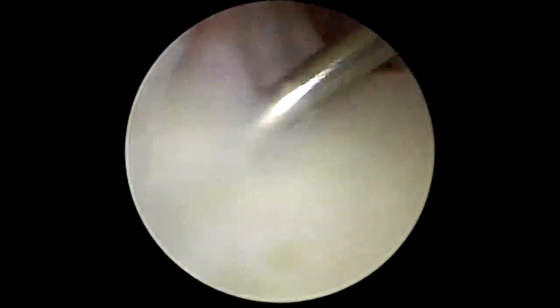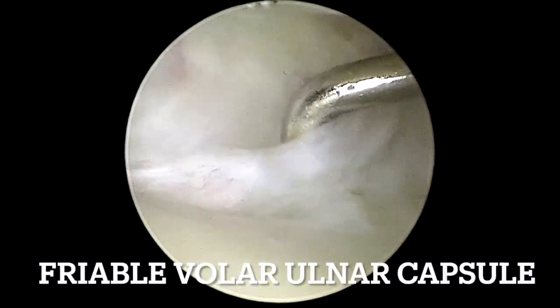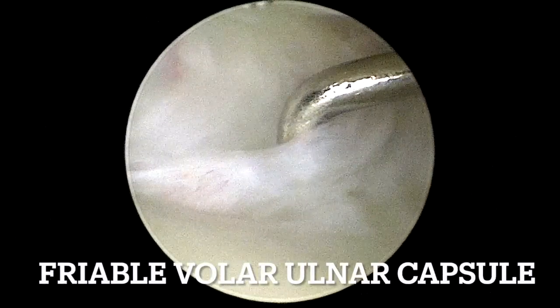One can assess the ulnar carpal ligament complex by hooking the capsule towards the centre of the ulnar head. A friable volar ulnar capsule can be appreciated.